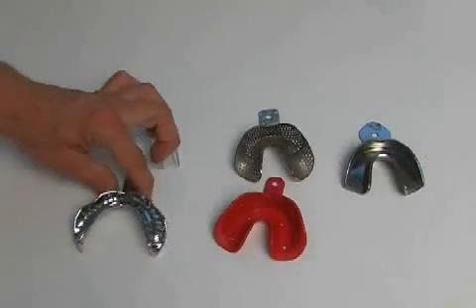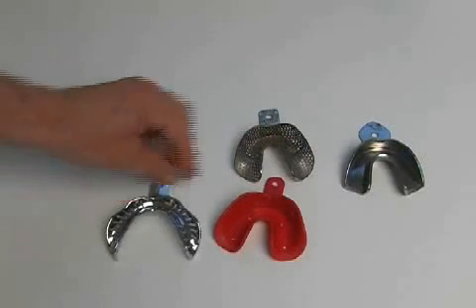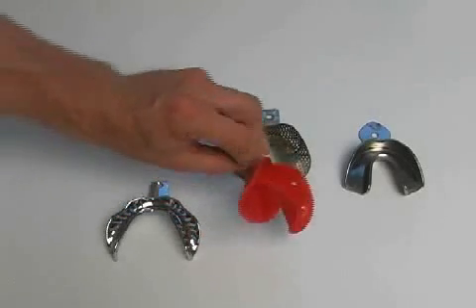The prefabricated trays are factory-made impression trays, made of metal or plastic materials, and come in a host of different shapes for toothed, partially toothed, and toothless jaws.